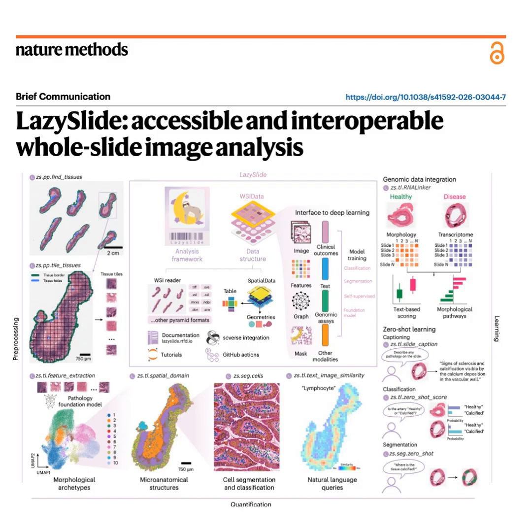No, it calculates probability-weighted averages for the underlying cell masks and computes the intersection over union. If the mathematical overlap exceeds a certain threshold, the system mathematically merges the two fragments back into a single, cohesive cellular polygon. That is brilliant. It completely resolves that border cell artifact, and it doesn't require massive computational overhead. It's incredibly elegant.